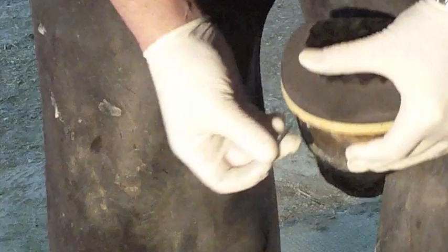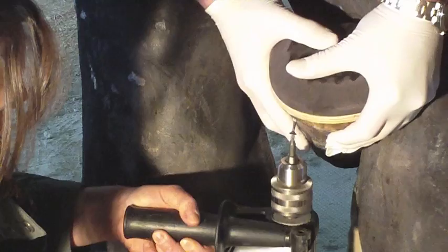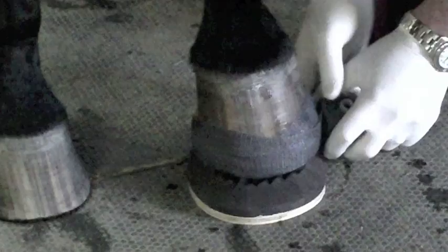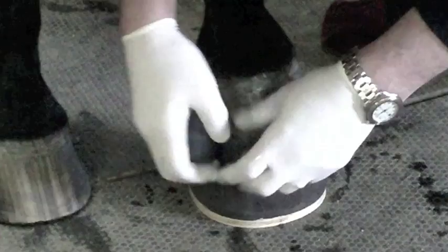I have my pilot holes drilled. I'm going to put the shoe on where I want it and then, with a helper, take one of the small sheetrock screws, go into the pilot hole and into the shoe, then one on the other side. Now we have some casting material to help secure it. I run it over the shoe, being careful not to get it on the hairline. I go underneath the shoe a little bit and wrap around and around until it's all done. As you can see, as the casting tape goes on, that side ridge doesn't really make that big a deal anymore.